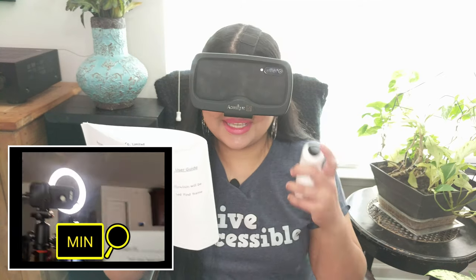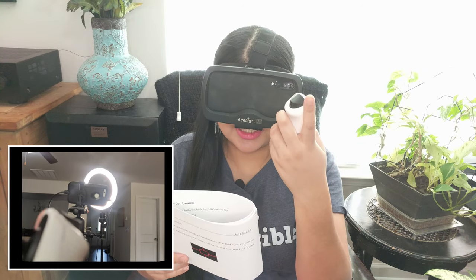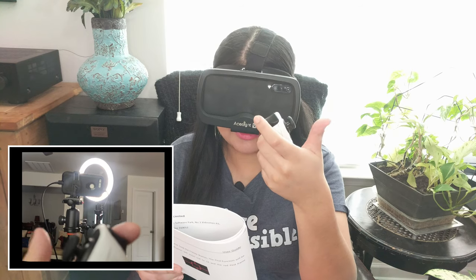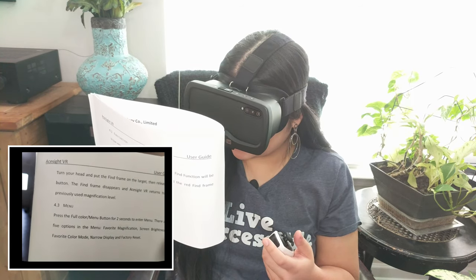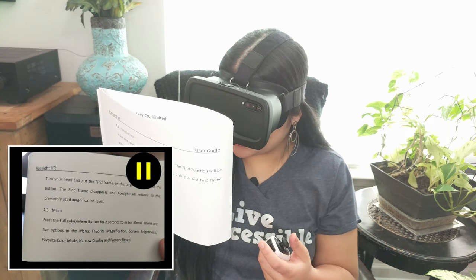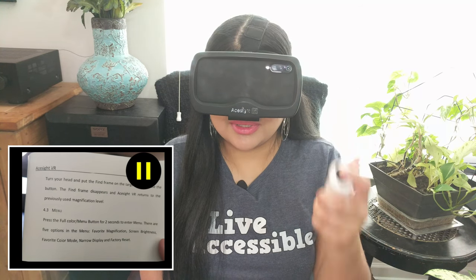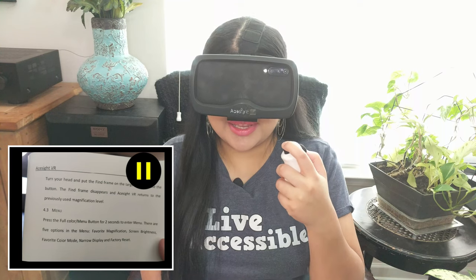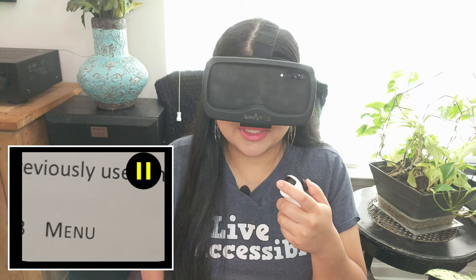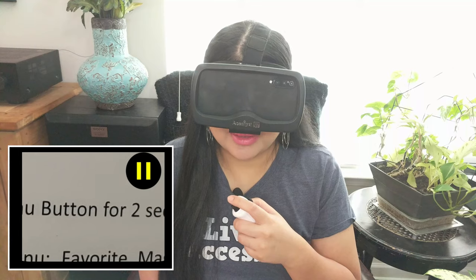The Acesight also has another button, which is at the top part of the remote. I usually press this with my index finger, and then the joystick, I usually use my thumb for it. And this one, if you do a quick press, it takes a picture. From there, it freezes the image, and what you can do is you can press and hold that trigger button and zoom in. And then you can pan around using the joystick. So if you wanted to read it in this way, instead of having to hold the piece of paper.